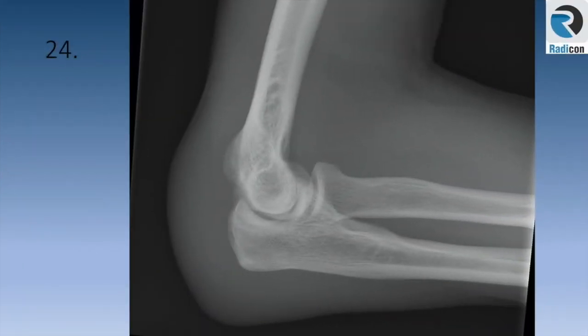Case 24: apparently normal bones with adequate articulation, normal joint congruity, no obvious effusion, fracture, or dislocation. However, once you review the soft tissues, there is extensive swelling on the posterior aspect of the elbow joint in keeping with olecranon bursitis.